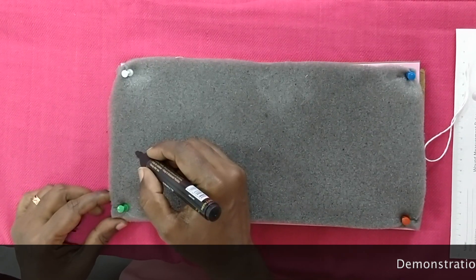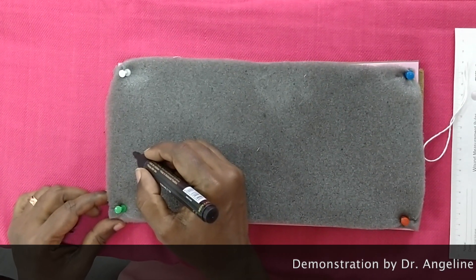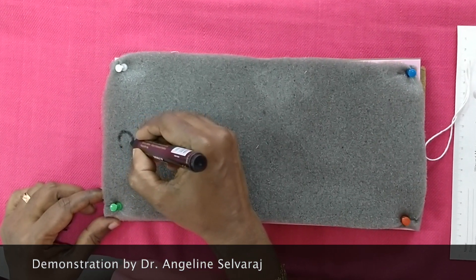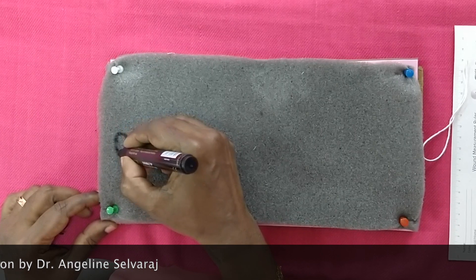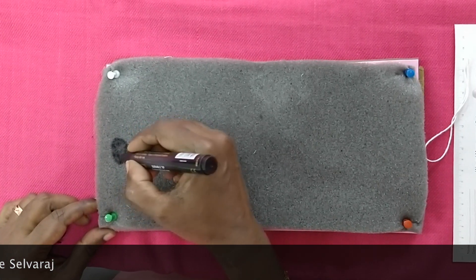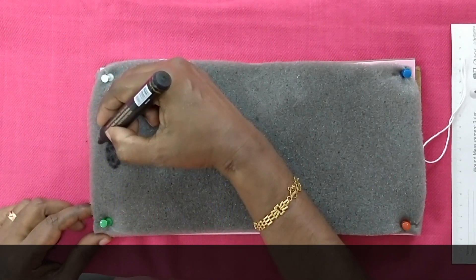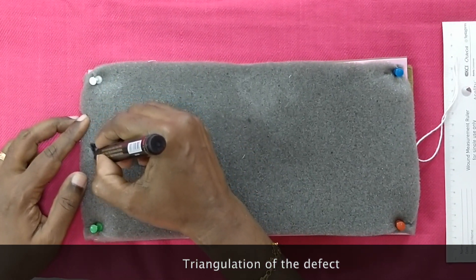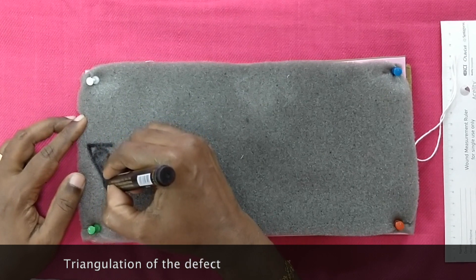We shall be seeing how the classical transposition flap as we have seen in the video is being done. First we will consider a defect, an irregular defect about 2 cm diameter. We shall have to first triangulate the defect, keeping in mind the principles that we have learned.